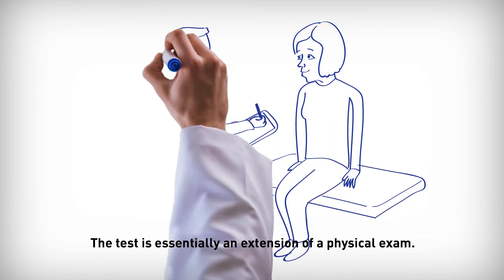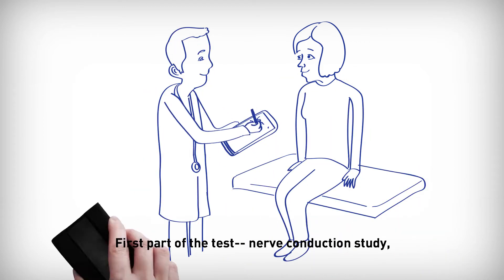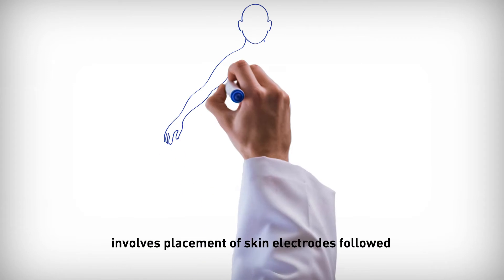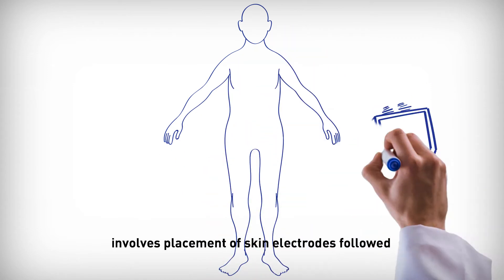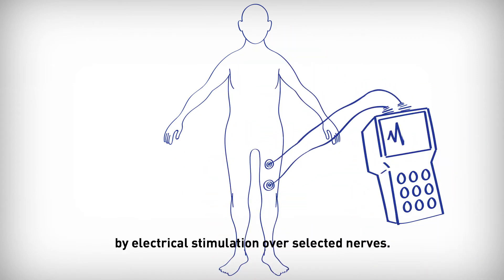The test is essentially an extension of a physical exam. First part of the test, nerve conduction study, involves placement of skin electrodes followed by electrical stimulation over selected nerves.